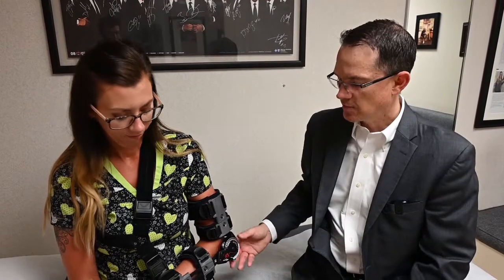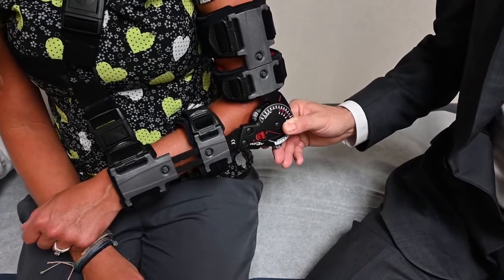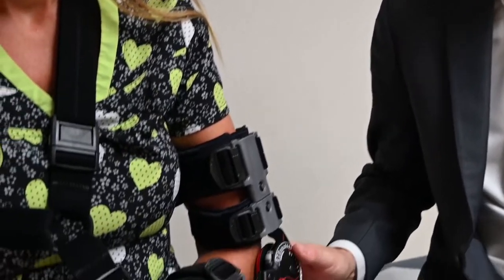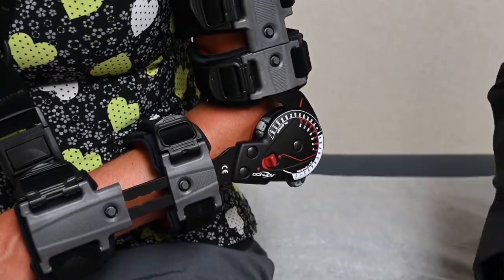This is our post-operative hinged elbow brace following a distal biceps repair. The point of this brace is to protect the repair from recurrent injury. Right now, we have this brace locked in 90 degrees of flexion. This is the typical position that I have patients in during their regular activities of daily living.